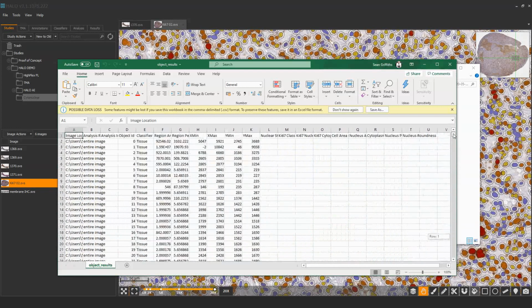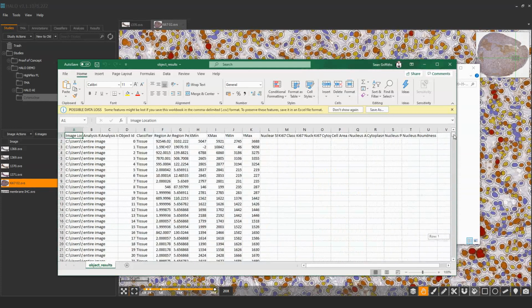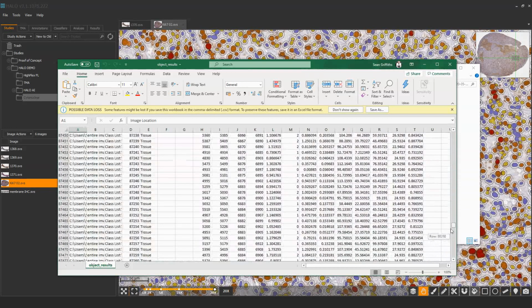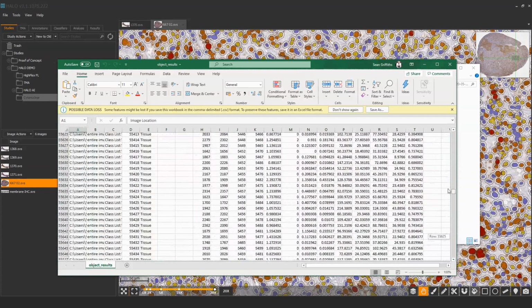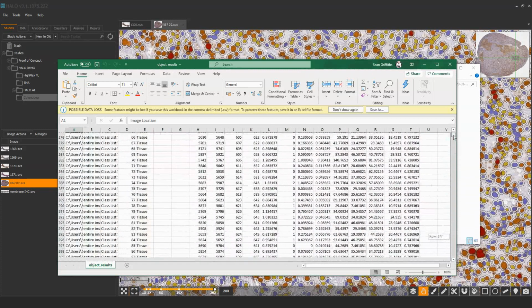It's changed in WebEx. It used to be the case that you shared everything, and now you're sharing individual things, and it's one of those habits that's quite difficult to break. So just scrolling down, we can see all of the cells in the data set, and the XY coordinates if you want to mine them.